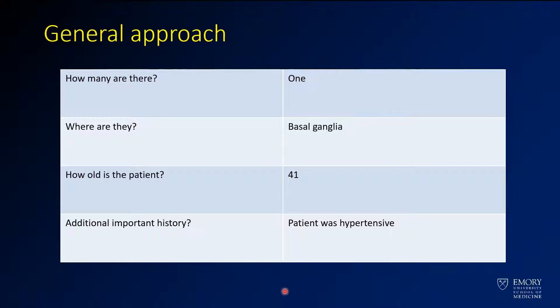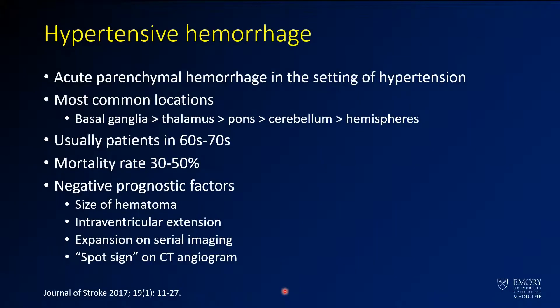This is a relatively young patient — only 41 years old. Some additional history: this patient was hypertensive. So when we're thinking about that, this ends up being a hypertensive hemorrhage. You've got an acute hemorrhage in the setting of hypertension.